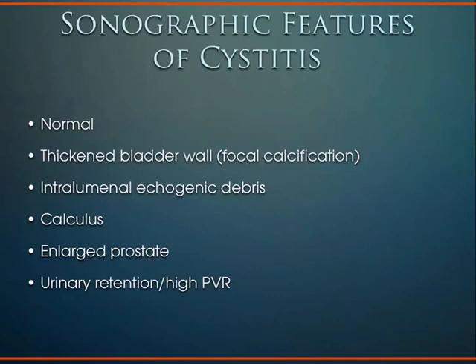You can also make a diagnosis of a bladder infection, or confirm the diagnosis. Again, usually it's a very clinical diagnosis, but sometimes the patient can't talk to you, or they're too young, or they're intubated, and you're wondering why they have a fever. As you're doing your fever survey with ultrasound, you can come down to the bladder and you'll see a thickened bladder wall.